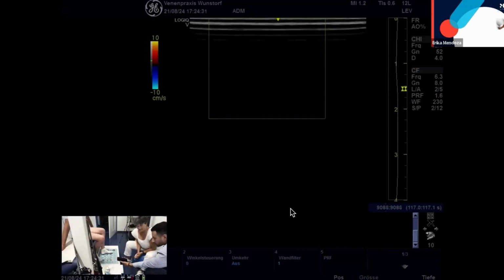This is what I presented to you, that you have a great saphenous vein dilated with diastolic flow, but in the correct direction. Is this clear, Fasila?